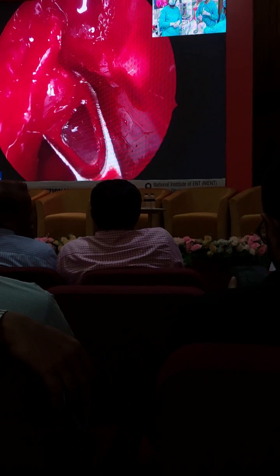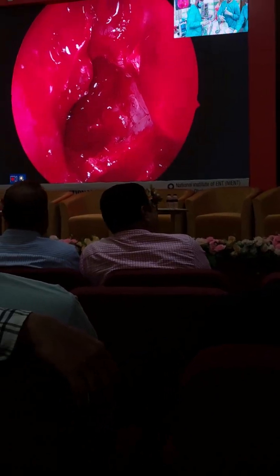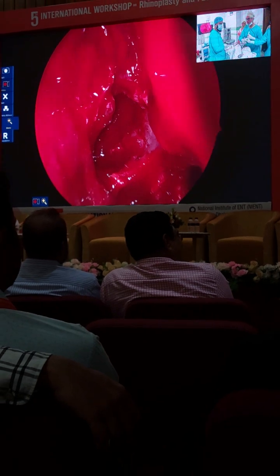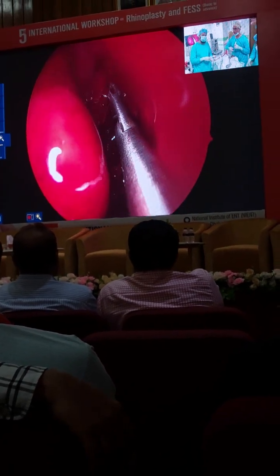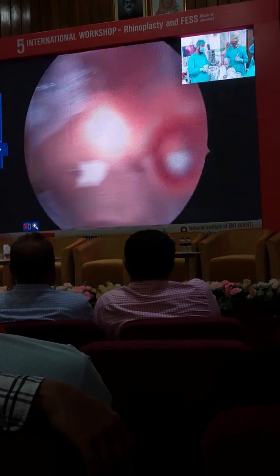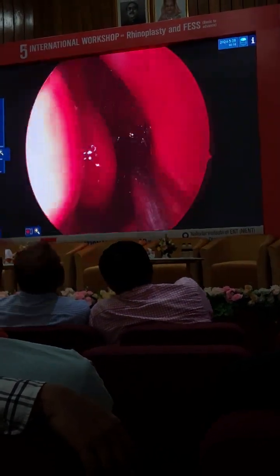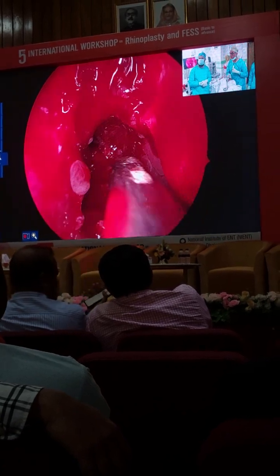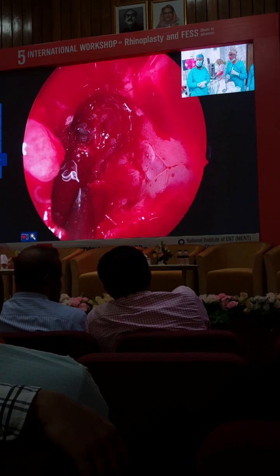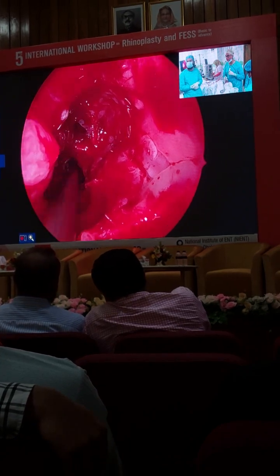Now with a wide curette, even if I was to expose dura, there is less chance of my cutting dura as against using a thin, narrow, sharp curette. Okay. So you should take a very wide curette. Yeah, same principle as in mastoid surgery, right? Okay. Larger barrel. Safe. Okay. So now you see it's sphenoid and you see that big ethmoid cell above it.